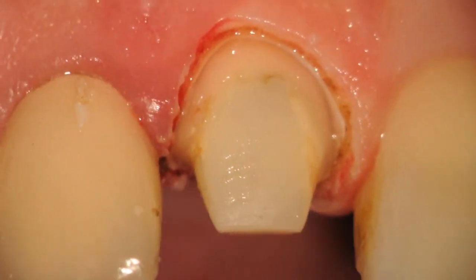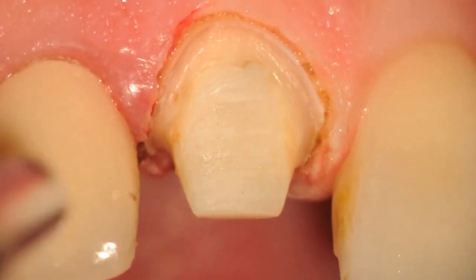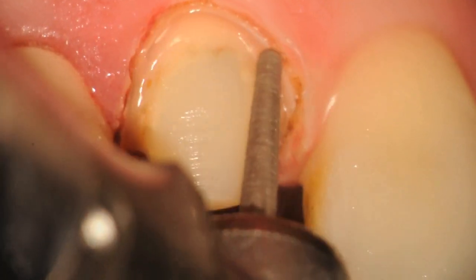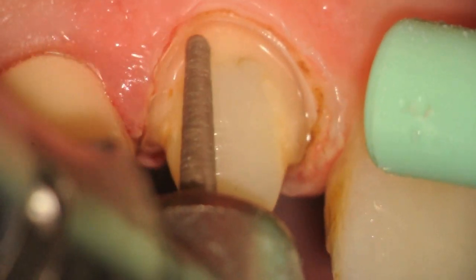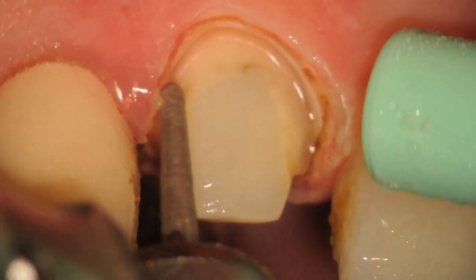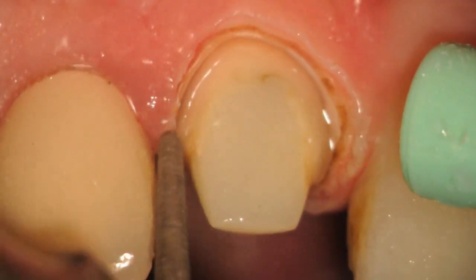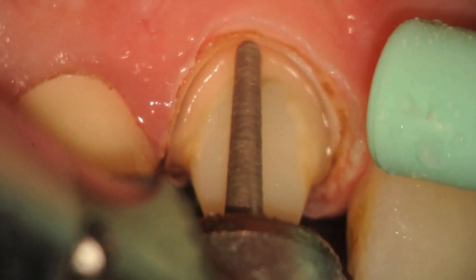Immediately afterwards, we need to finalize our margins. We will bring back a smooth diamond or sonic instrument and refine the margins so they're equi-gingival to the prepared sulcus. This will also remove some debris and give a clean appearance to the margins so the lab can differentiate where the tissue and margin are. Using the electric handpiece at low revolutions, we remove any ledges and J-hooks to make the margin equi-gingival.